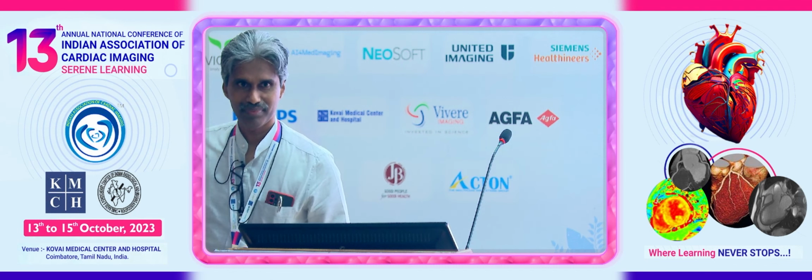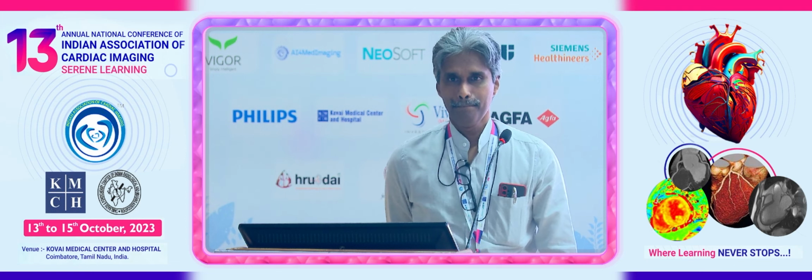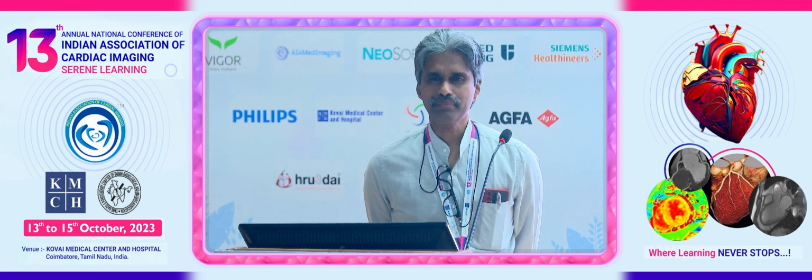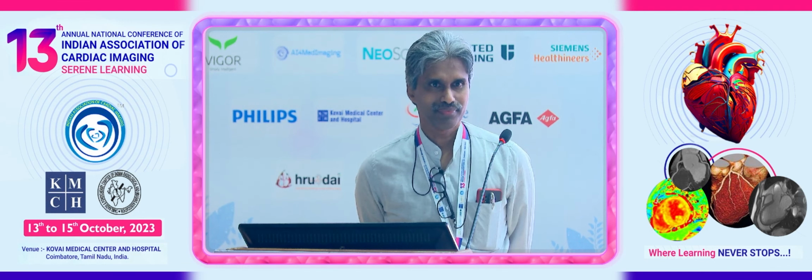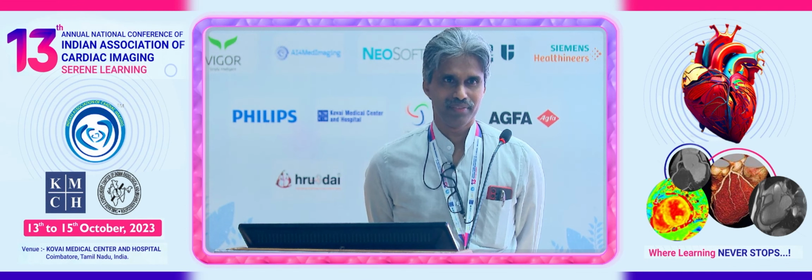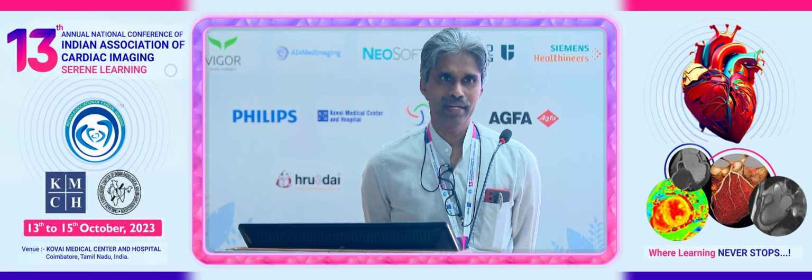I think Alpa has spoken about T1 and T2 mapping in kids, but most of our scans are not done with breath hold. So how do you know that motion has not affected the values? We have motion correction software, which does fairly well.